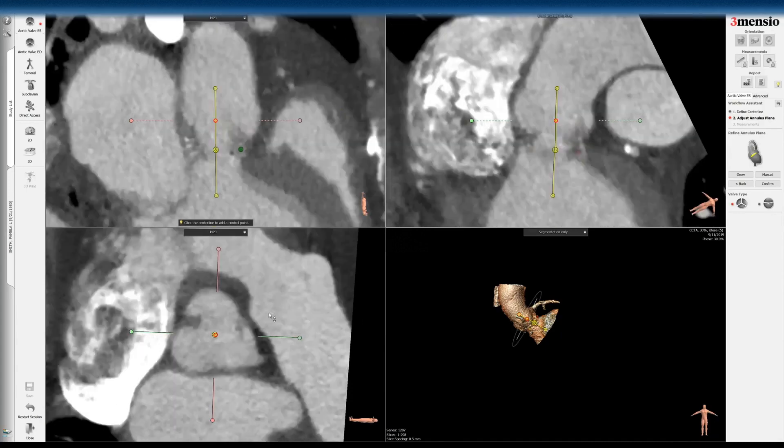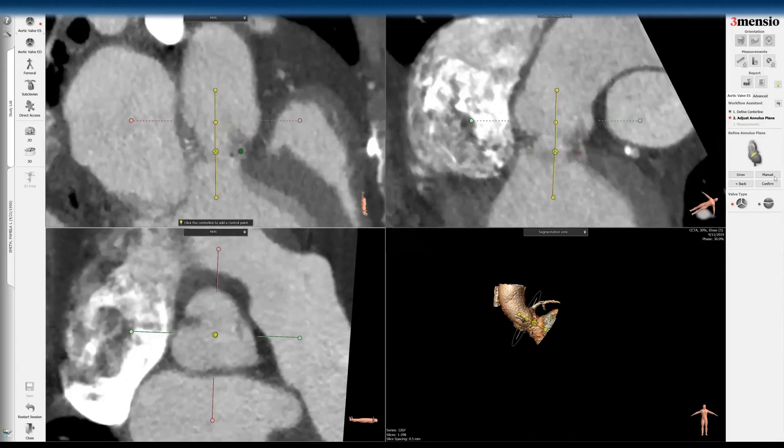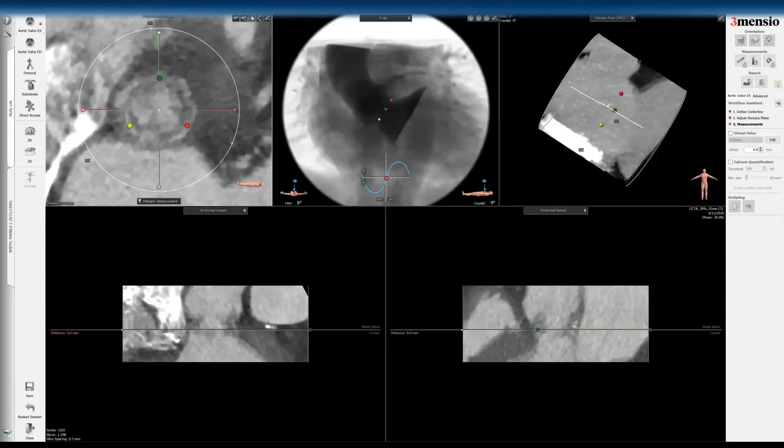This is about as best as we can manage, so I'm going to click confirm. You can see now how this looks. And then using the lasso tool, we're trying to go around and trace out the inner diameter of the EPIC valve. The stent ID of the 21mm EPIC valve is 19mm, but the true ID is actually 17mm.